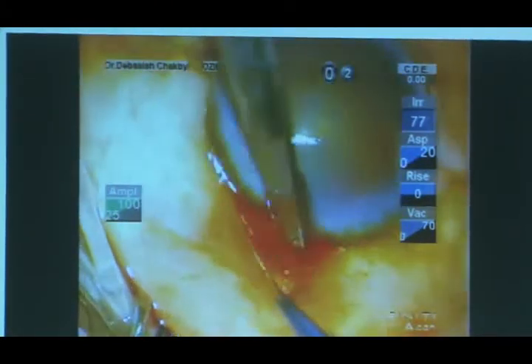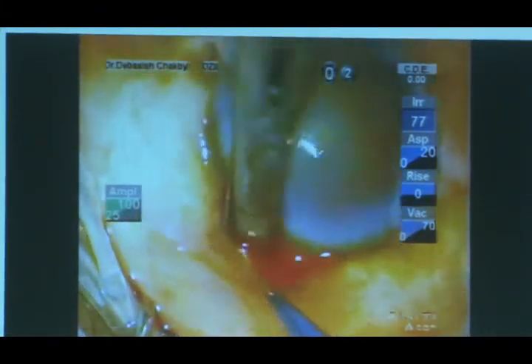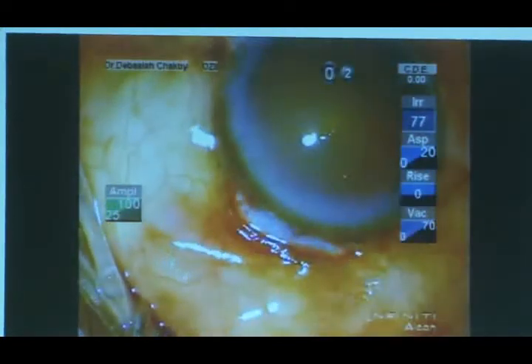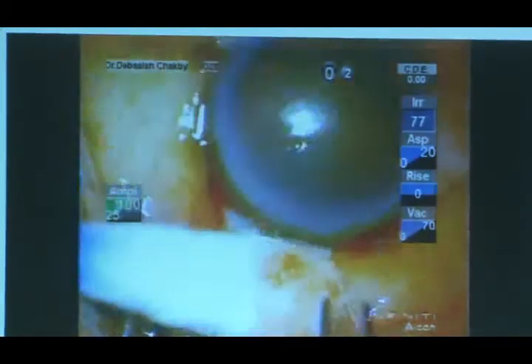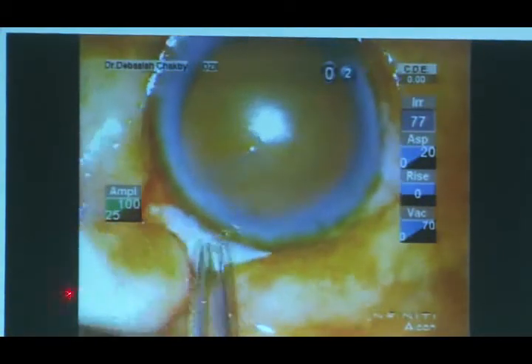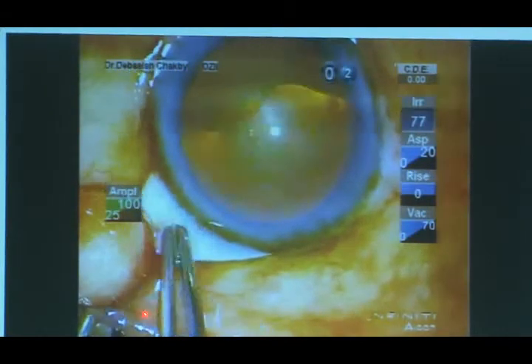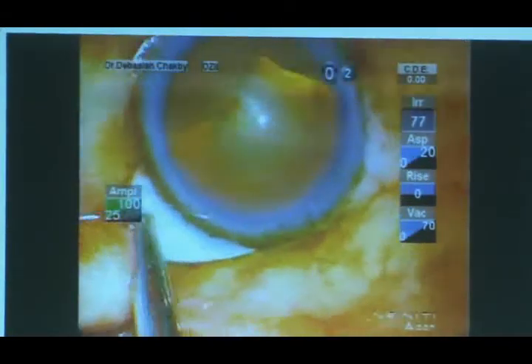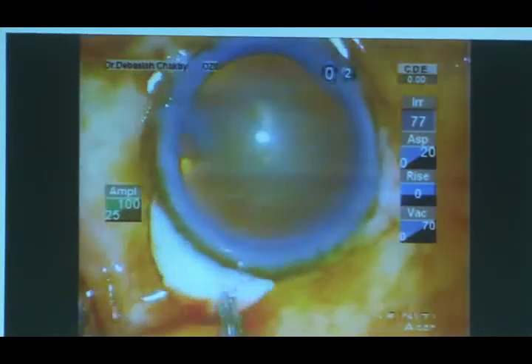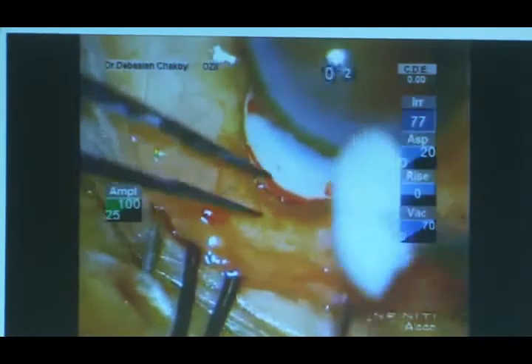After that, the important part is to go as far posterior as possible. Insert the tips of your Westcott scissors as far posterior as possible so that you get a diffuse bleb which is more posteriorly located. After we have made the conjunctival incision, we have to apply light bipolar cautery to any bleeding vessels in the area where we are planning the scleral incision. It should be only light; you should not apply very heavy cautery.